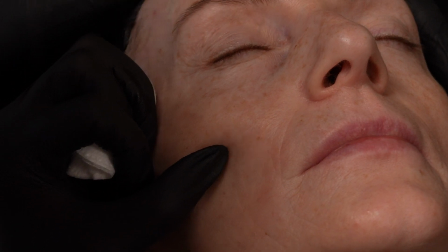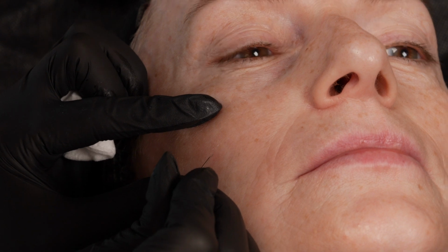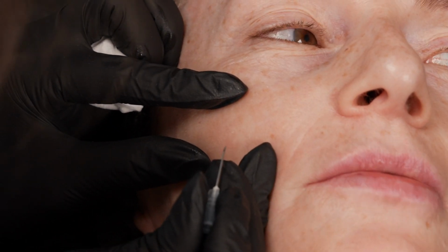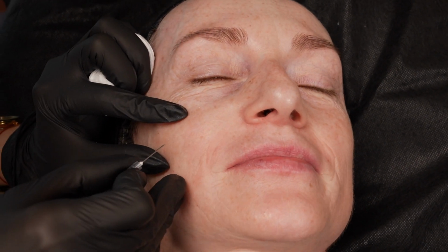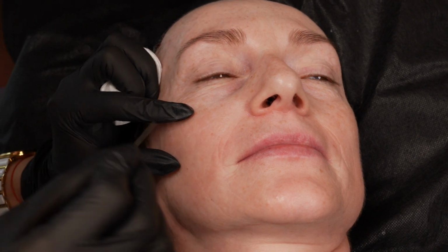It's coming. One needle. One more time. I don't know if she understands or not. Do you understand English? No, she cannot understand. Tell the patient when you do it. It's for the better, because they are medical terms. For opening, at an angle I make the puncture here. You don't need to go deep, no, just pass through the dermis.